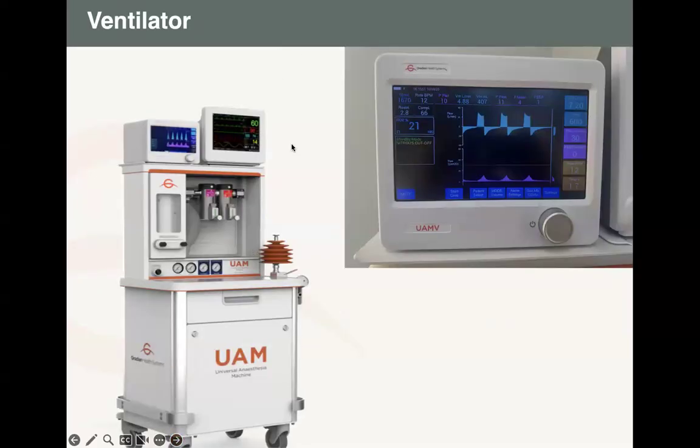Okay, so this is our machine. Those who have the machine have seen that your UAM has two valves, as shown there. But that can be discussed later, maybe in one of the webinars. Today we are concentrating on the vent, as shown in the zoomed picture of the ventilator. As you can see, there are settings, but also measured values, graphs, and the parameters which the machine is giving you. Next.